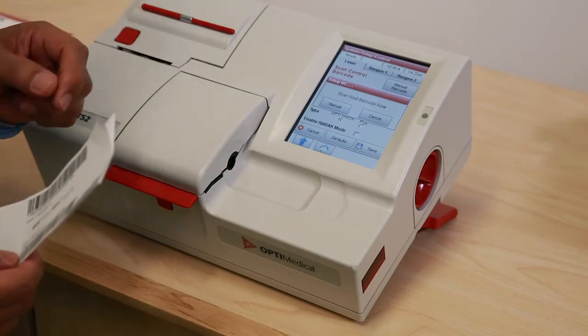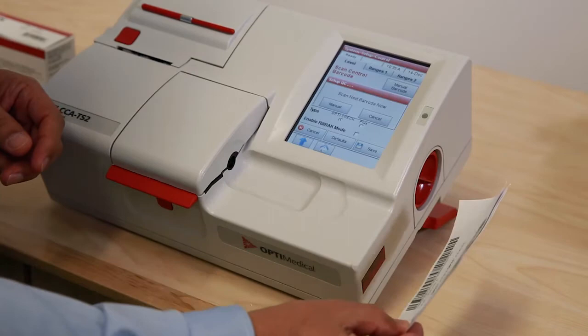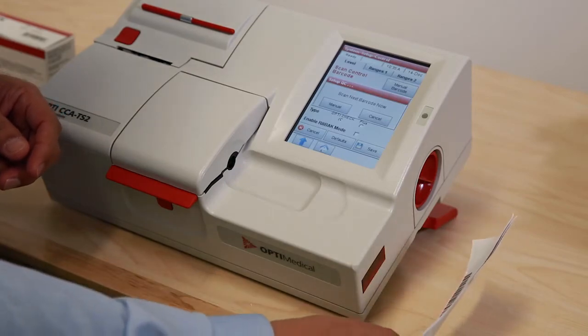At this point, the instrument prompts to scan the next barcode, so the next barcode is scanned into the analyzer.